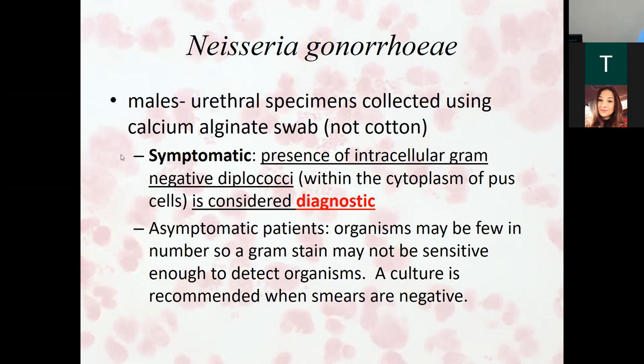You're going to be that person that has to say, this is what we need. So you've got to educate. You've got to take your little rayon swabs and say, I need these, and they need these labeled for strep throat or strep collection. These are the ones we want to use, because the nurse thinks they're helping you. They think they helped you out. They went ahead and got the throat swab. They just grabbed whatever was in the little sterile packaging, kind of like ours the other day in lab, right? With those two little cotton swabs in a little pack. They'll just grab those and do it, right? And those are great for throat cultures, but we can't use those for the kits. The kits are designed to work with the special little swabs.